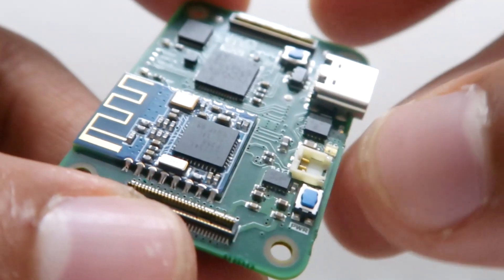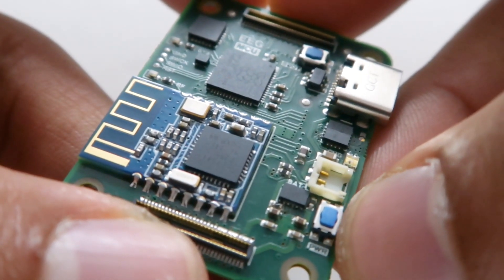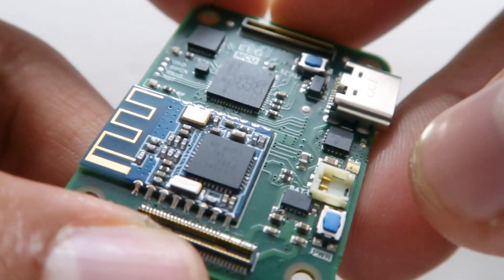It also has a push-button controller — this button has to be pressed down for three seconds to switch the board on or off.